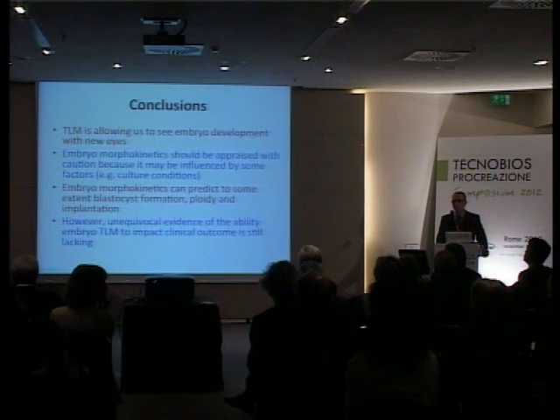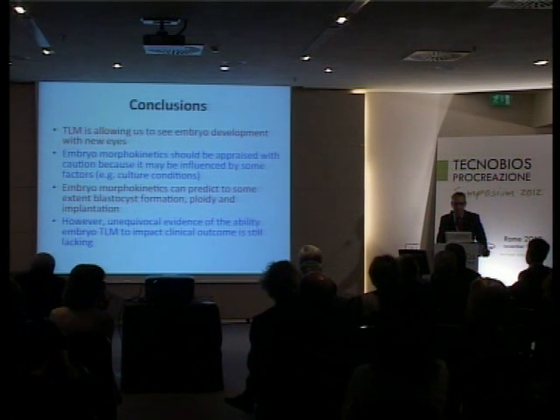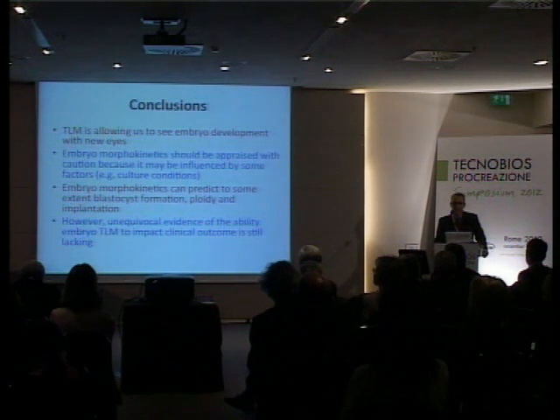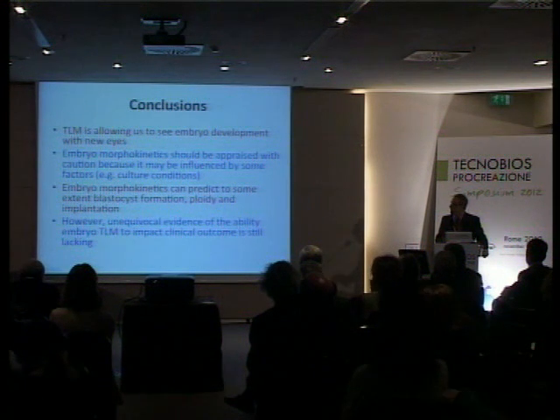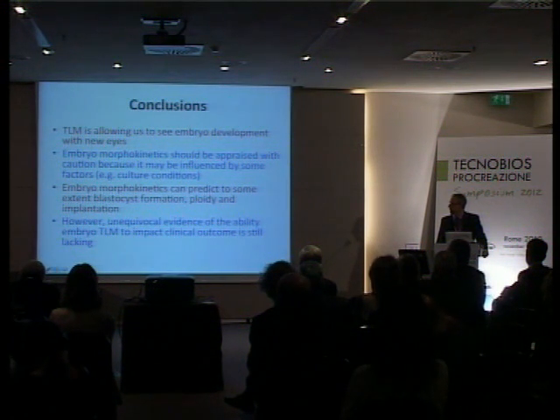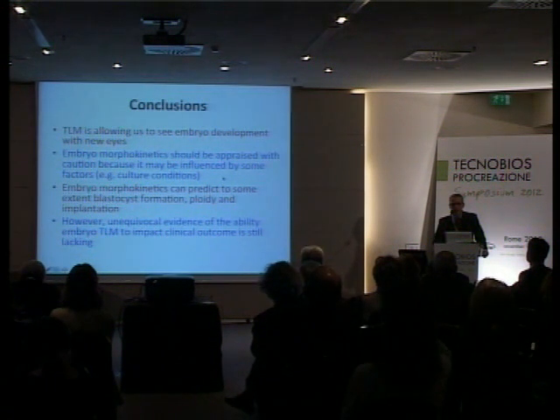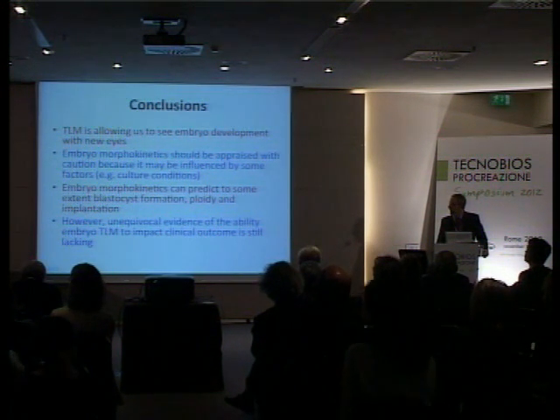We've seen things that we could only dream of a few years ago. So we have lots of food for thought for a better understanding of embryo development in vitro. But we need to be careful because there may be bias due to the technology, due to other influences that we can introduce with the manipulation.